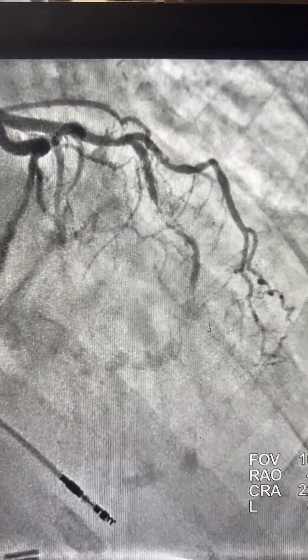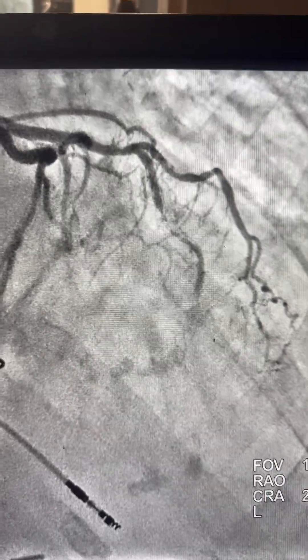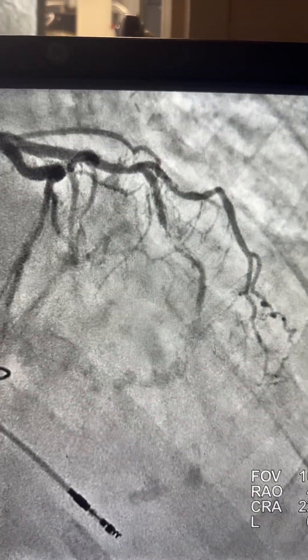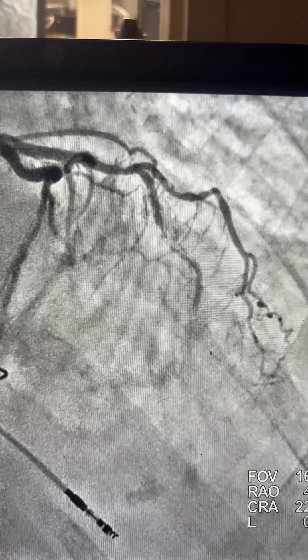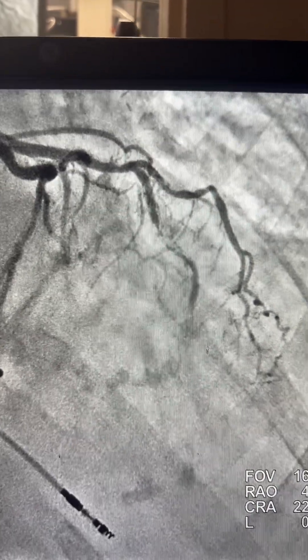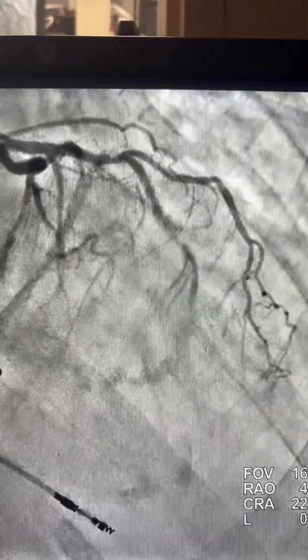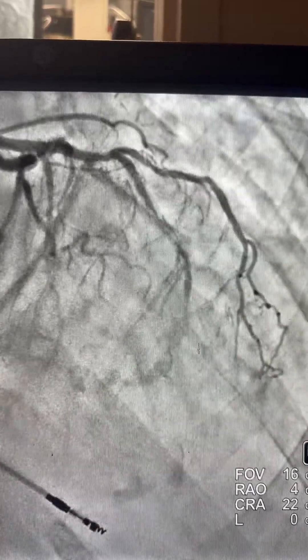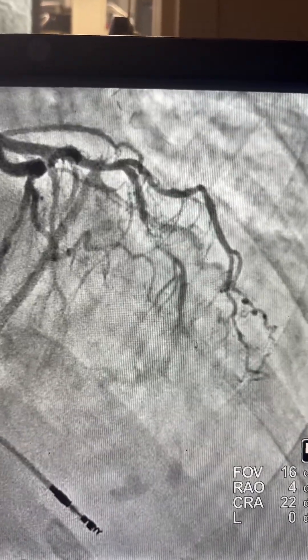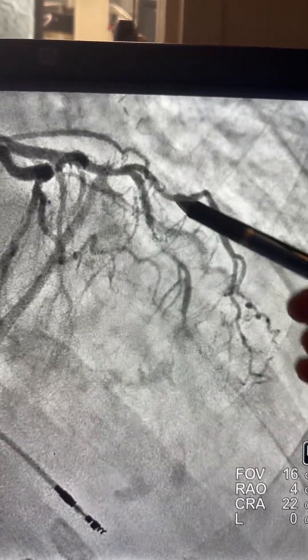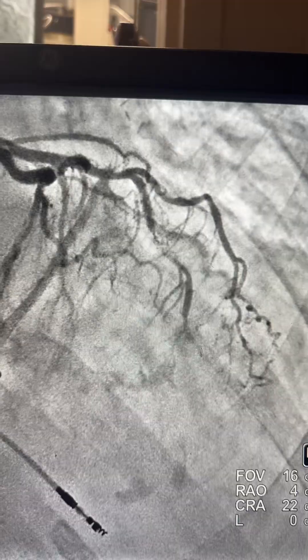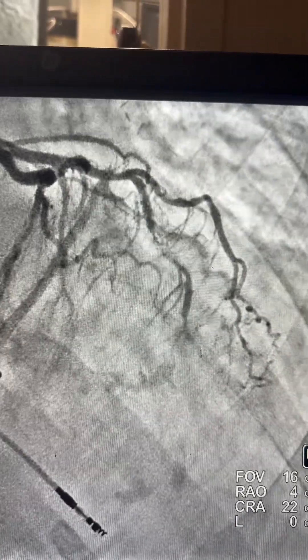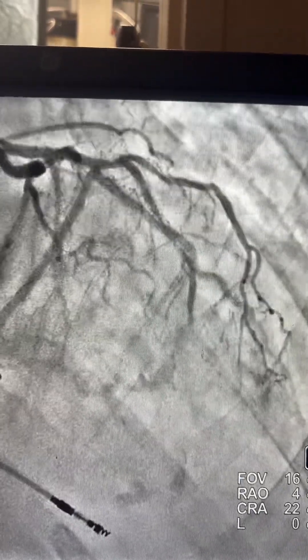Hello everyone, it's Dr. Hamo again. We have a 73-year-old lady with acute non-STEMI, post-op, with a history of bypass. You can see we have those lesions — the LAD in-stent and the large diagonal, which is an unprotected vessel.